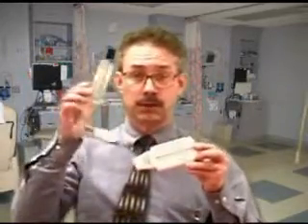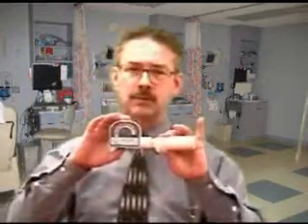This presentation is on performing and instructing your patient to do a peak flow. There are many different styles of peak flow meters. These are some of them. The one that we're going to use today is this one.